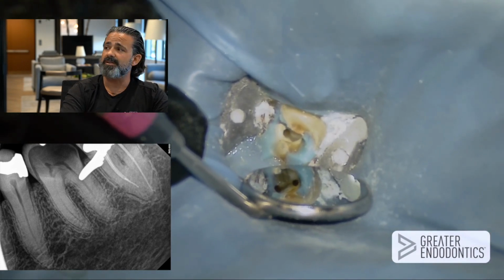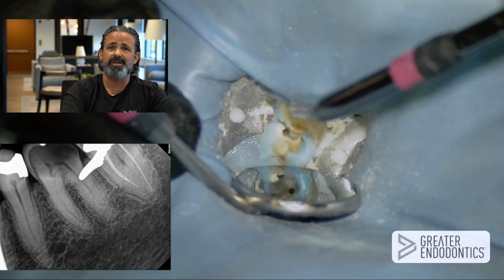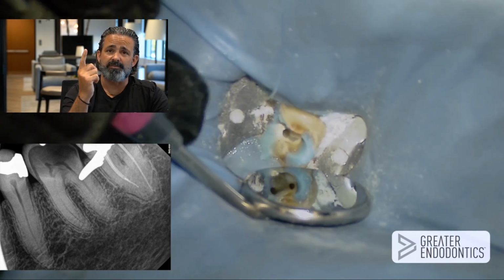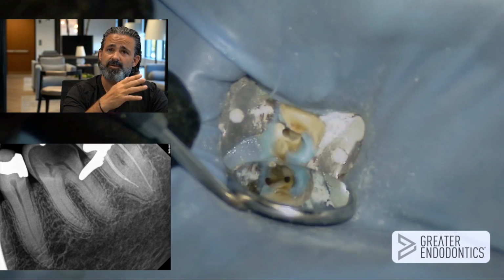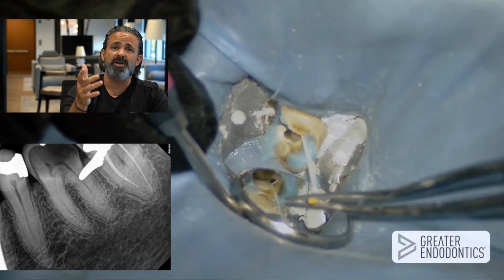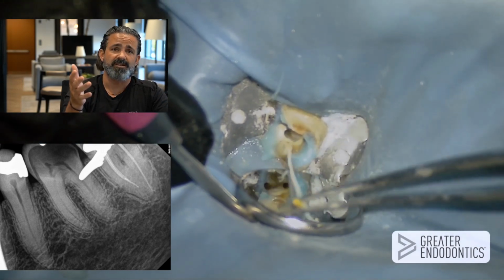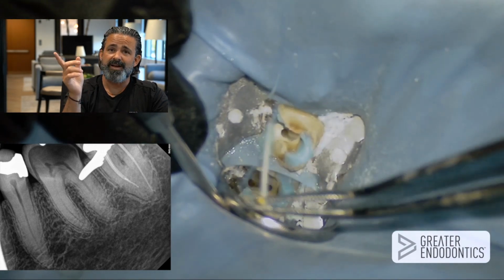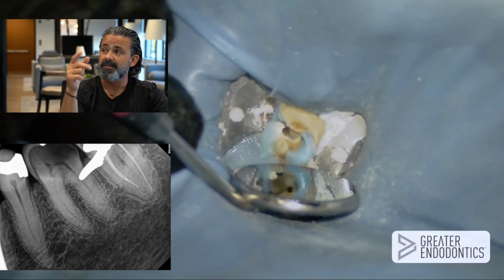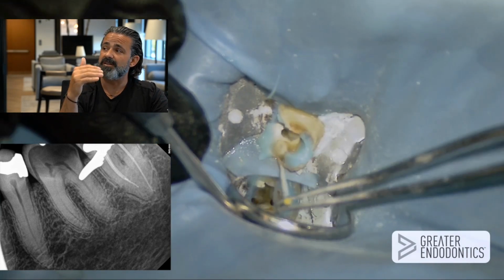And you know what? Is this even possible with the GentleWave? And what happens if there's more than one? Which one are we going to pick? What if there's 10? What if there's 3? Well, all I know is my file is going in one of them. I don't know anything else. Pre-GentleWave, post-GentleWave, if I do it, believe it or not, I don't know. But we know that a lot of teeth have a lot of foramina. And which one I found is all I find. But I knew I didn't find any of those before the GentleWave on this case. Now I did the GentleWave. Now I find it. And now I'm happy because I know at least I'm to terminus, I'm to length.